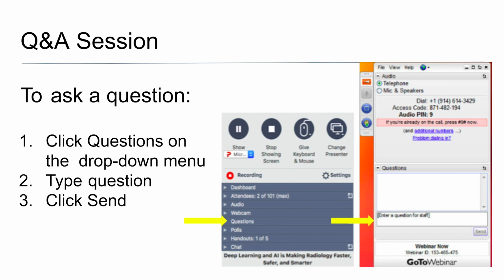I think this is a similar question: is this FDG dose reduction for PET MR only, or will the algorithm work for PET CT? Yeah, it's similar to what I just answered. So a similar idea can be used in PET CT. But here we talk about PET MR because it also provides extended usage, since on the MR side there's no radiation. So if you further reduce the PET dose, you can really give a really low dose, safer and more accessible exam.